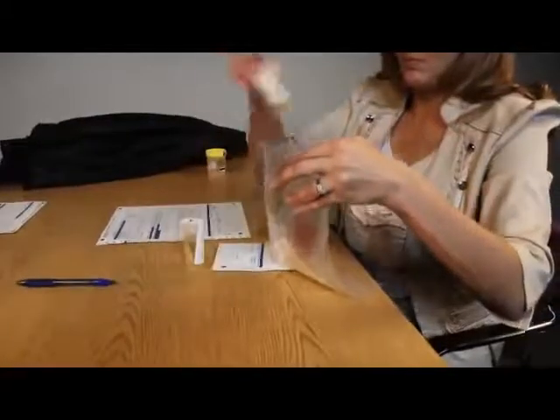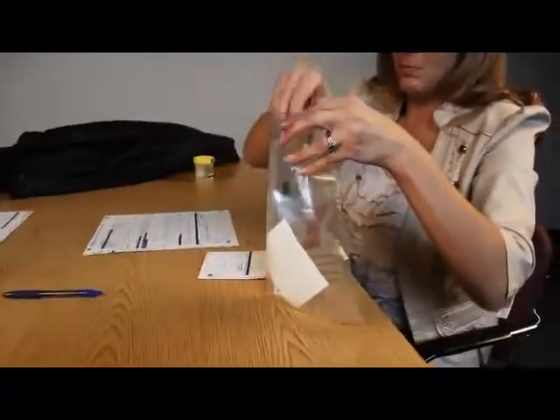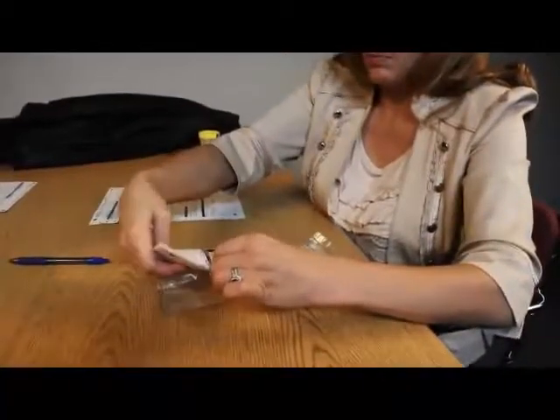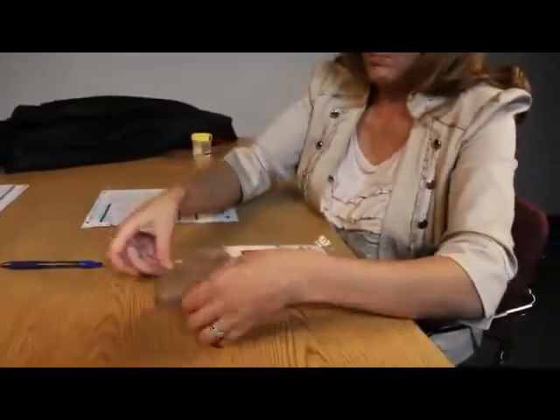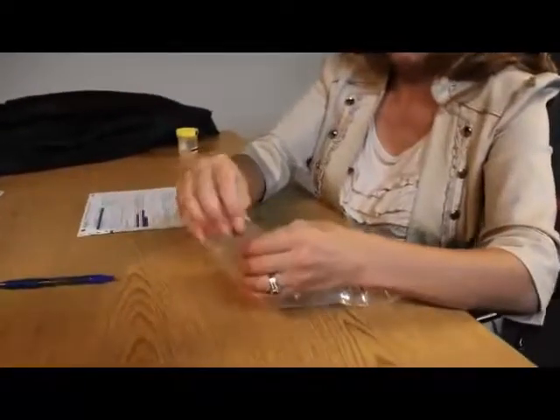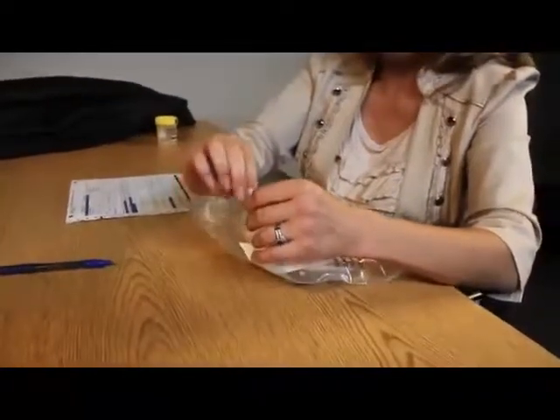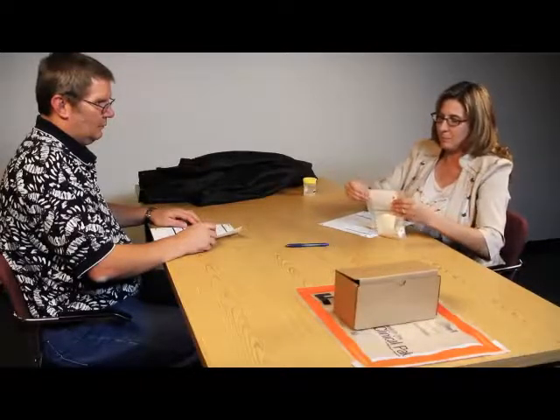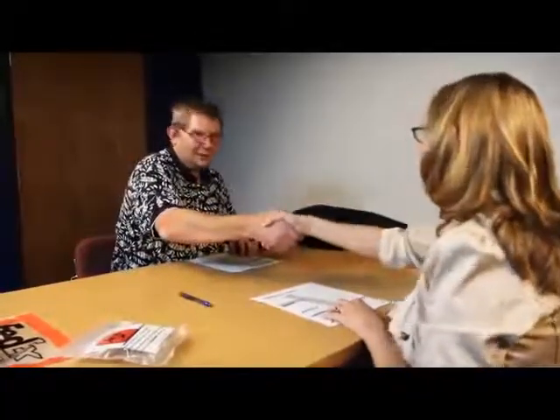Place the specimen bottles and copy 1 of the CCF inside the appropriate pouches of the leak-resistant plastic bag and seal both pouches. Inform the donor that they may leave the collection site.